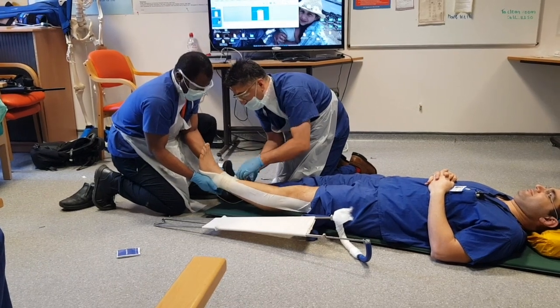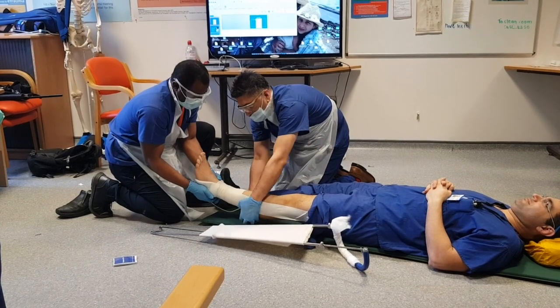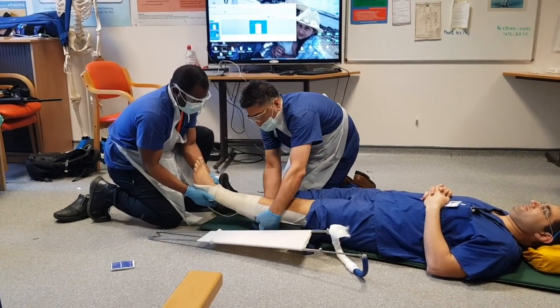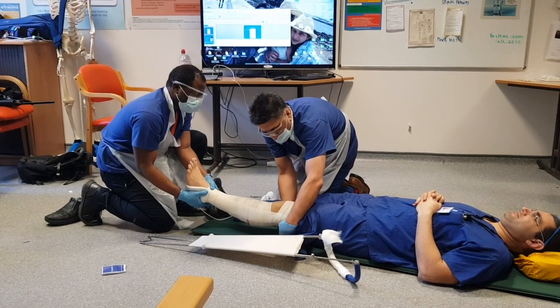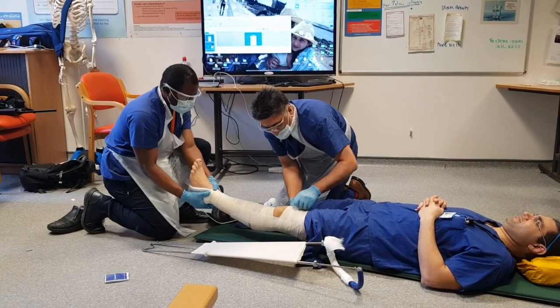Starting above his medial malleolus, I'm going to wrap it around the leg. I'm going to leave the knee out, and again I wouldn't go more proximal than where the fracture was.